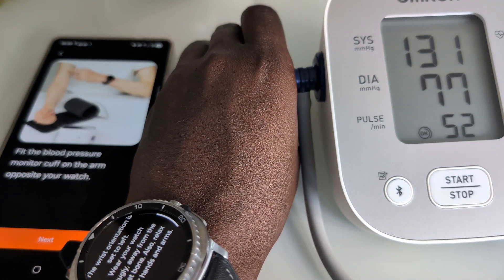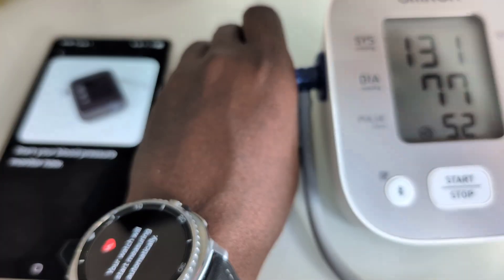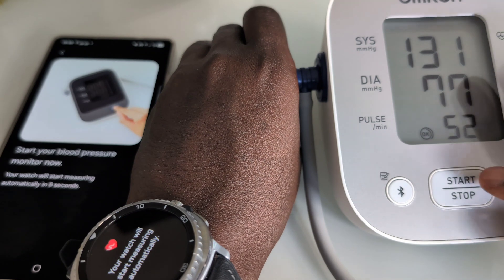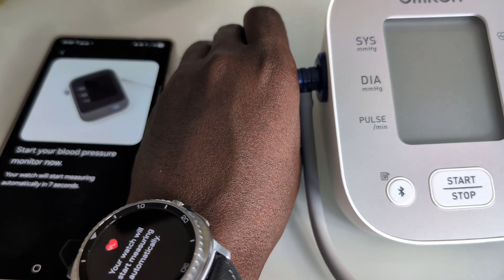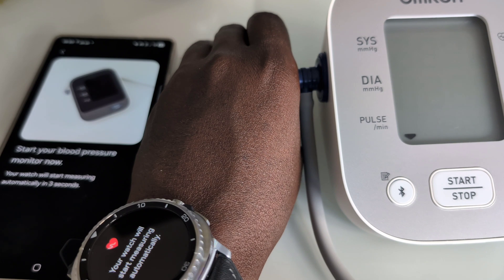The Watch 8 Classic — the classic that has been in the mix for a long time with the rotating bezel. Today we're trying to recalibrate the Watch 8 Classic to be able to read blood pressure.